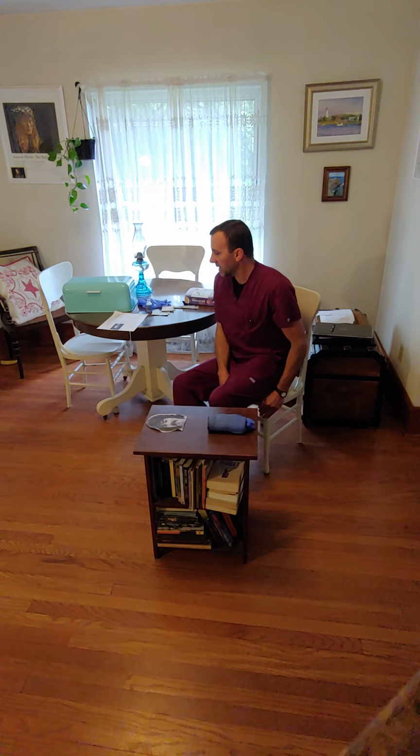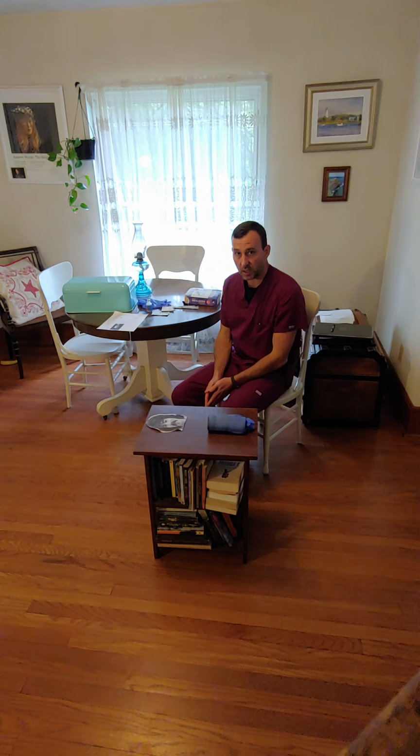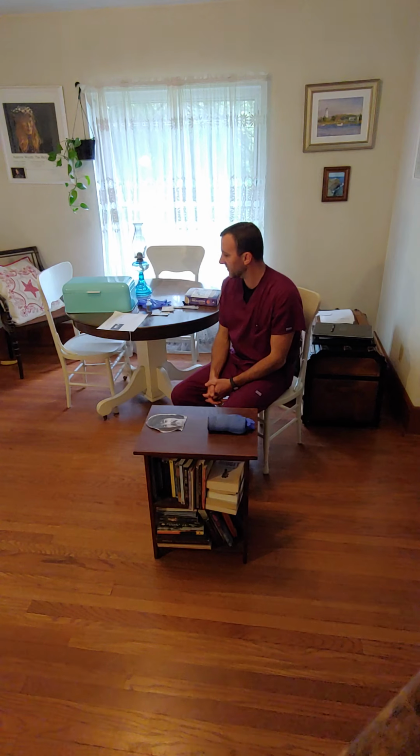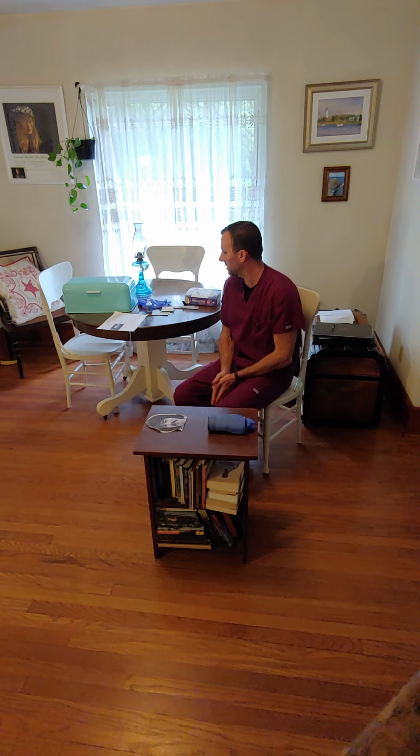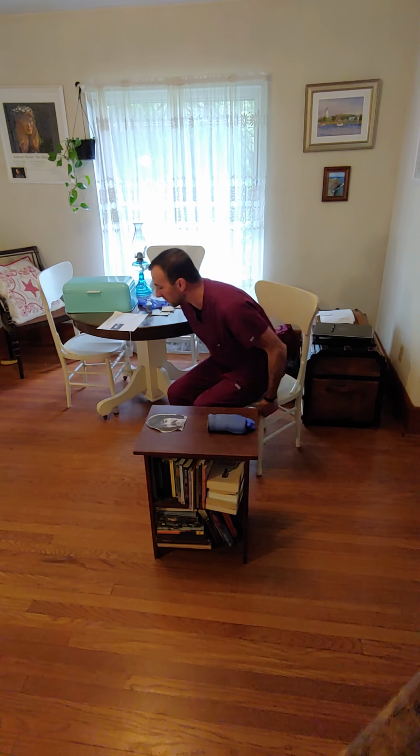Gonna do my intramuscular injection skill checkoff video for you this afternoon. I've got my equipment assembled here, and to start, I would double check the order that I have on hand with the original order in the medical administration record, or the electronic medical record.